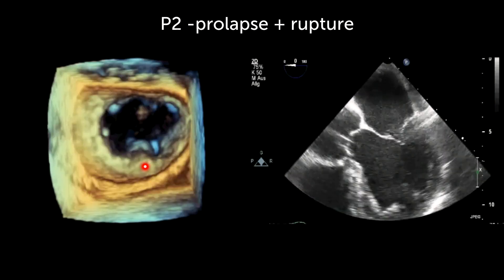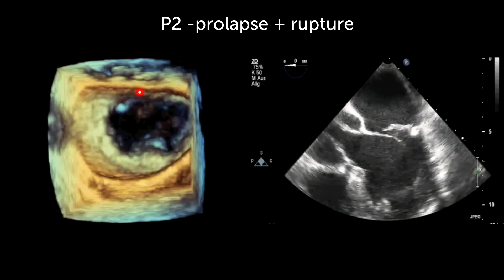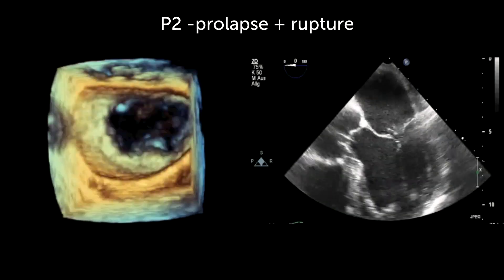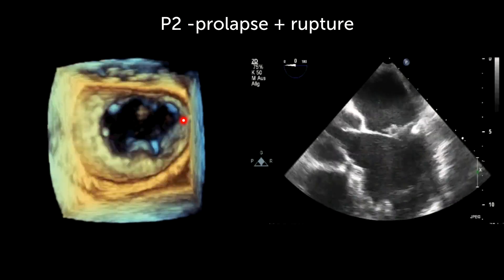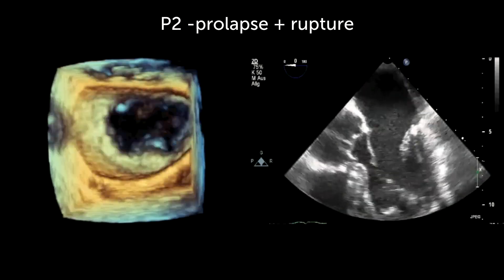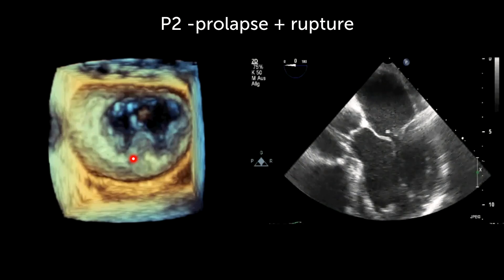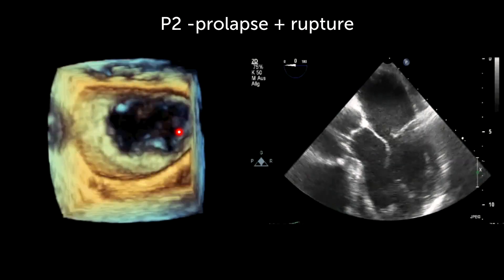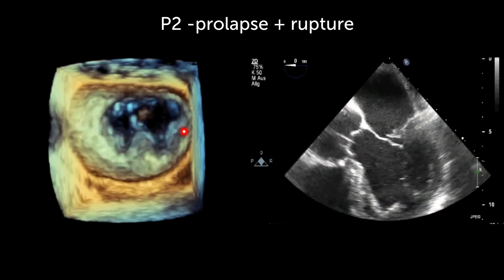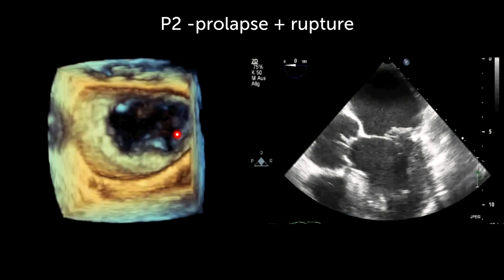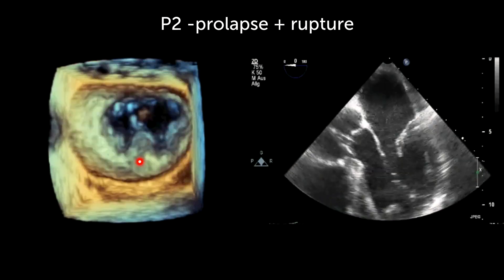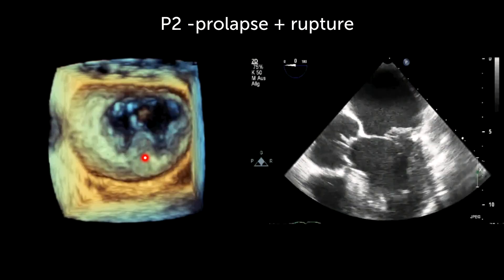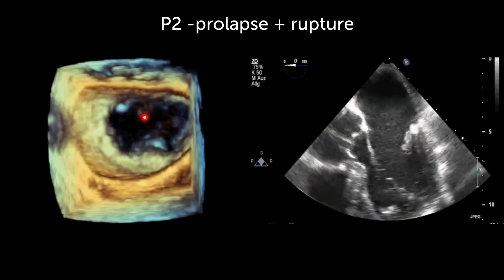For review purposes, this is the anterior leaflet A, this is medial, this is posterior, and this is lateral. And here we have P3, P2, and P1. So it's P2 which is involved.